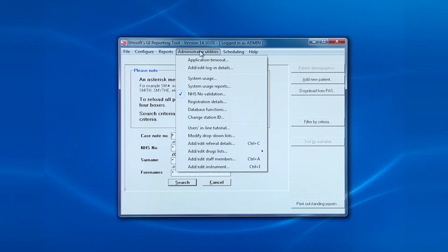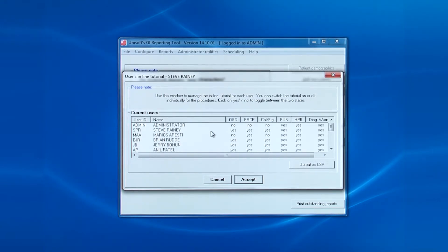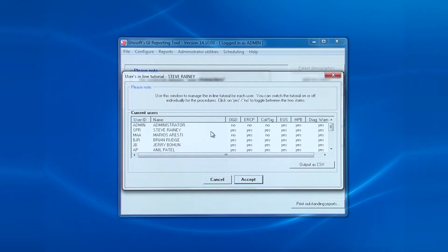Now we come down to the other important entries. The first of these is the inline tutorial. These are the red instruction windows that appear when endoscopists enter reports. After a while, these will become unnecessary and can be switched off for the user and for particular procedures.